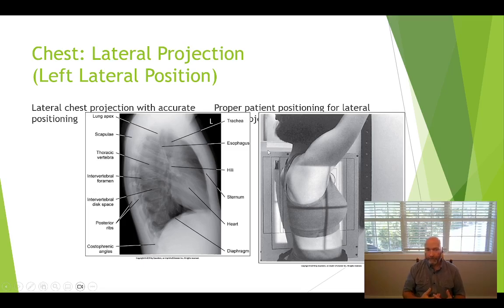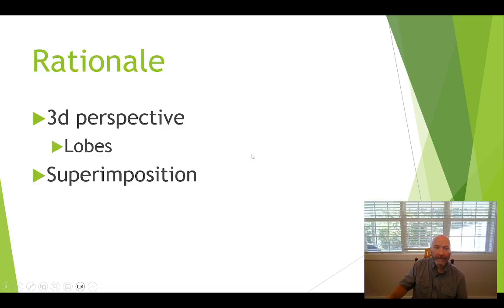Now, I'm going to do another video that goes through decubitus chest X-ray. I'll touch on obliques, but we really just don't do a whole lot of obliques. Decubitus chest X-ray, apical lordotic X-rays, and with the exception of the apical lordotic, what you need to file away in your mind is that for all chest X-rays, the centering point for your central ray is T7. All right, so keep that in mind, but at the same time, be a little bit flexible in your thinking here in just a minute, and I'll get to that in just a second.